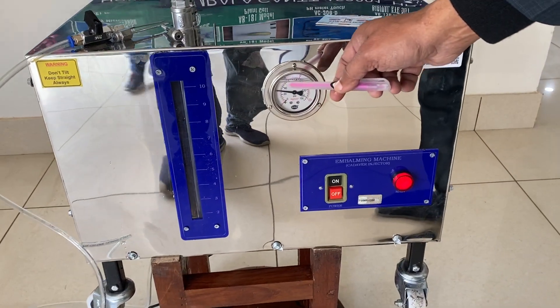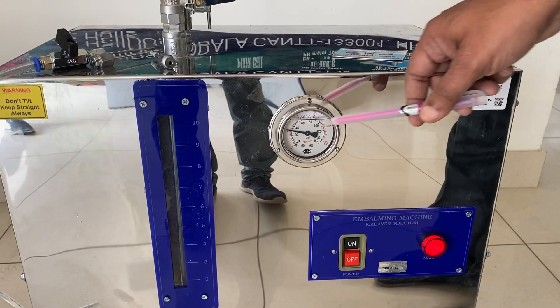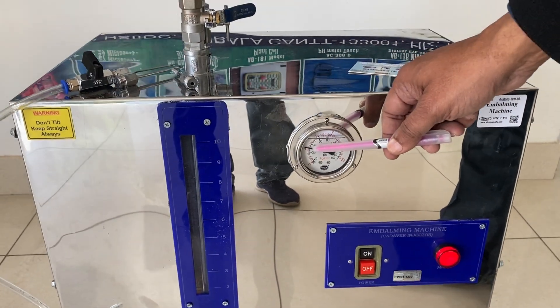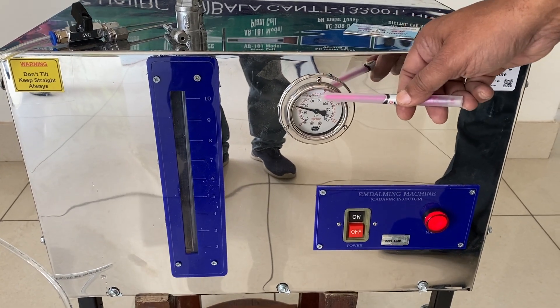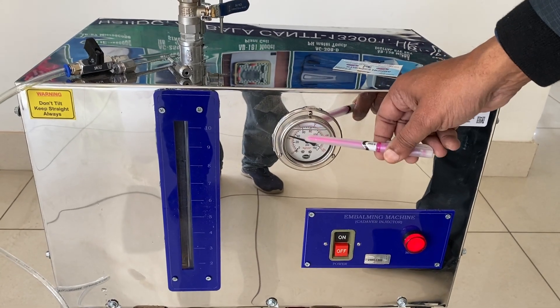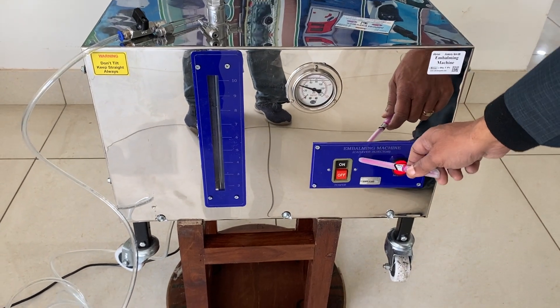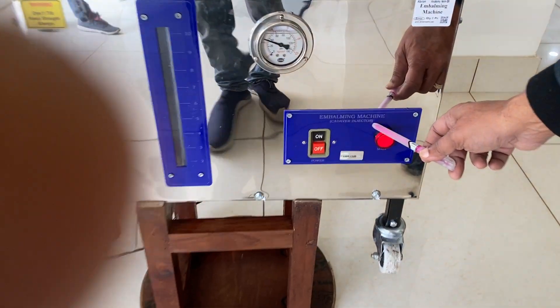When the pressure is about 40, then you start filling the body with the formalin. And up to 60, it will stop automatically. But you don't need to wait until 60 — just start working at 40. The pressure is sufficient at 40 for putting the formalin in the body.